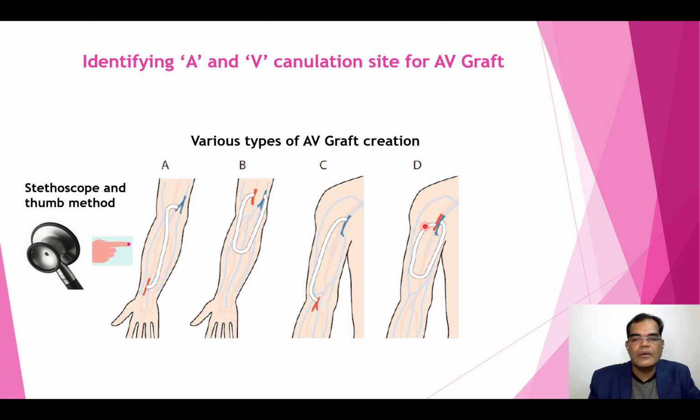So we cannot take it for granted this side is artery or this side is the vein, because it may be in the other way also. So if you needle wrongly, a place supposed to be the artery, if you needle a venous needle, the venous pressure go very high, and that can create exorbitant amount of recirculation and patient land up in poor dialysis. So how do we analyze, or how do we understand where to needle A and where to needle the so-called V?